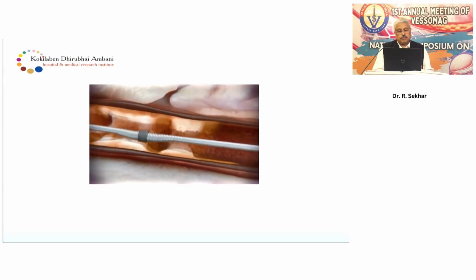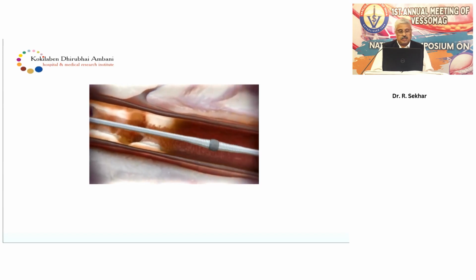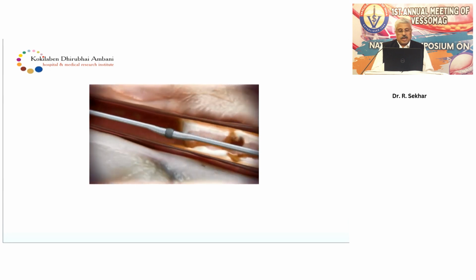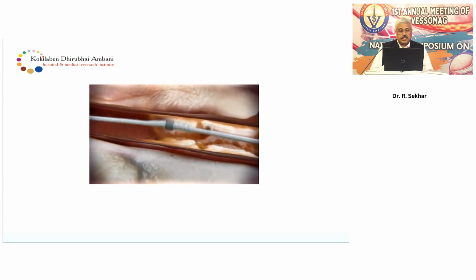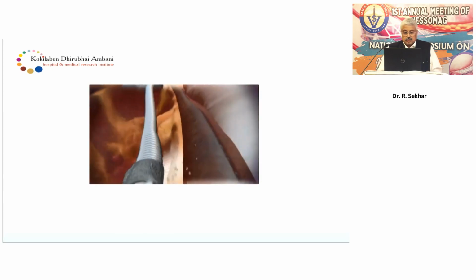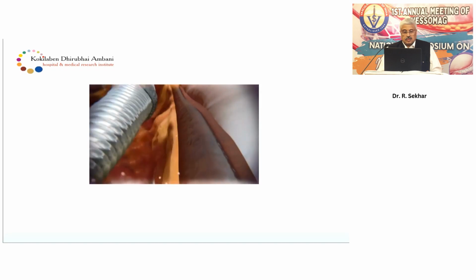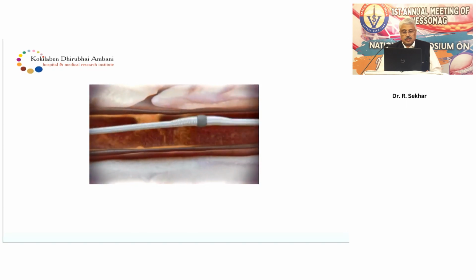I find those are the best cases where you can use an atherectomy, because the muck that goes down is minimized. As you can see, this diamondback oscillates 360 degrees and literally like sandpaper shaves off the whole plaque. This is a brief video just to show you what it does.